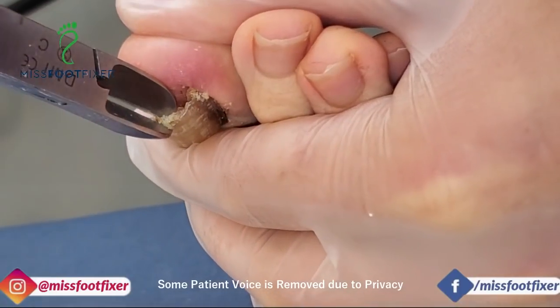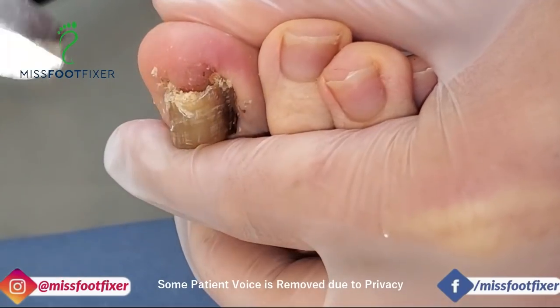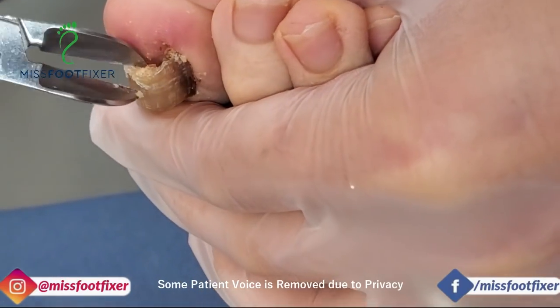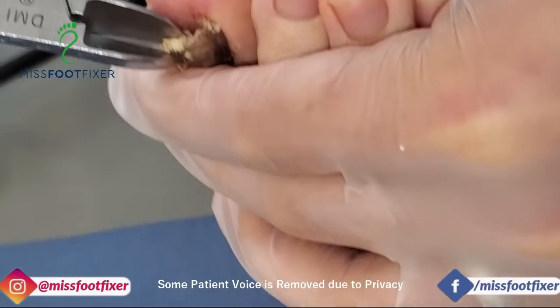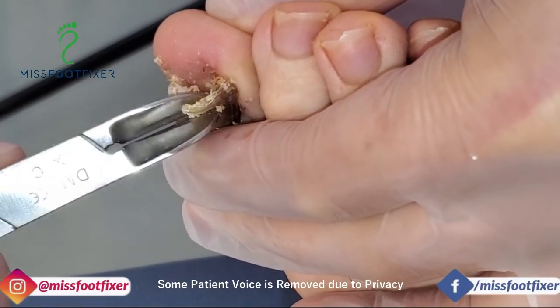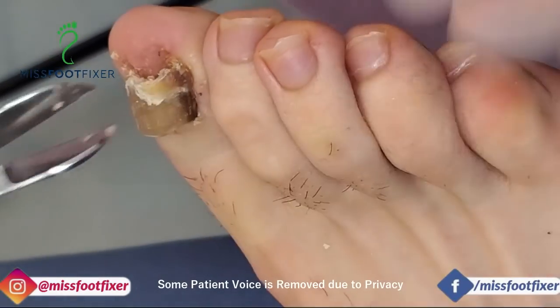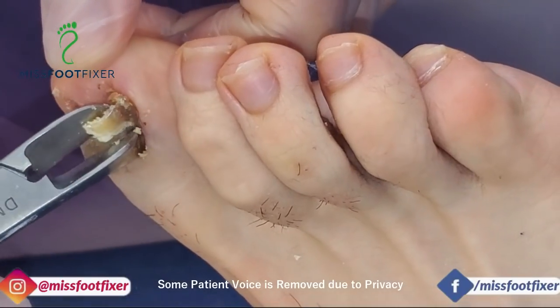Feel a bit of pressure. So you shouldn't really feel anything whilst I'm doing that, but it's just when I get around to the edges that it gets a bit sensitive. Excellent, that's a good piece. This is a good chunk of nail that's going here. You feel a bit of pressure.